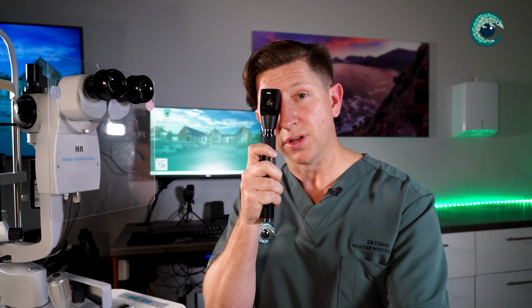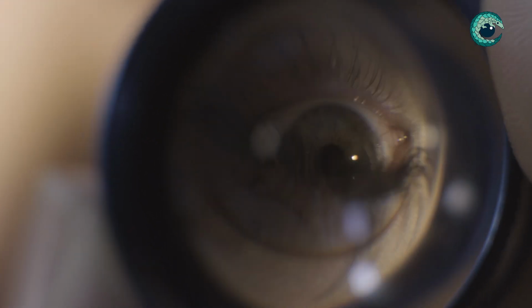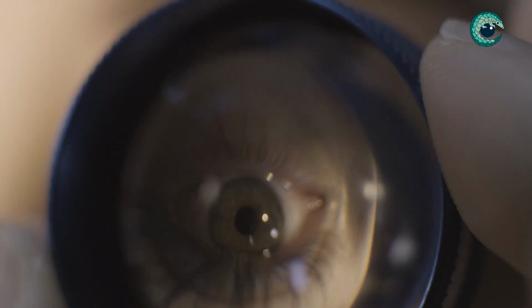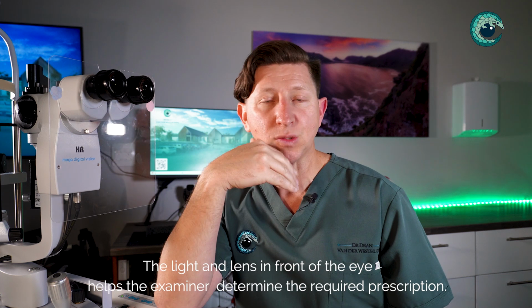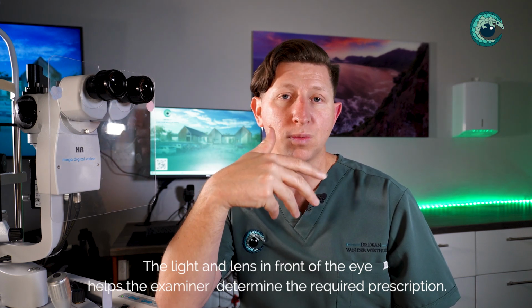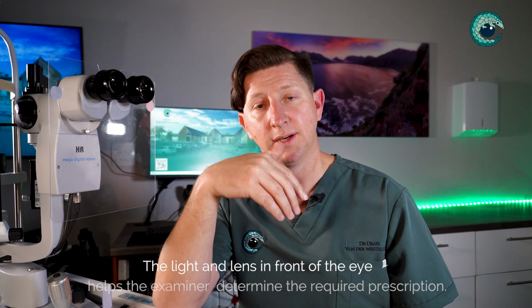Then by placing different lenses, we have a variety of different strength lenses that we can use, normally placed up towards the child's eye, in front of the eye, we are able to assess the strength of the glasses script, and that gives us a much more accurate reading of what prescription is required for the child. This can be done in patients who are unconscious as well, who can't respond.